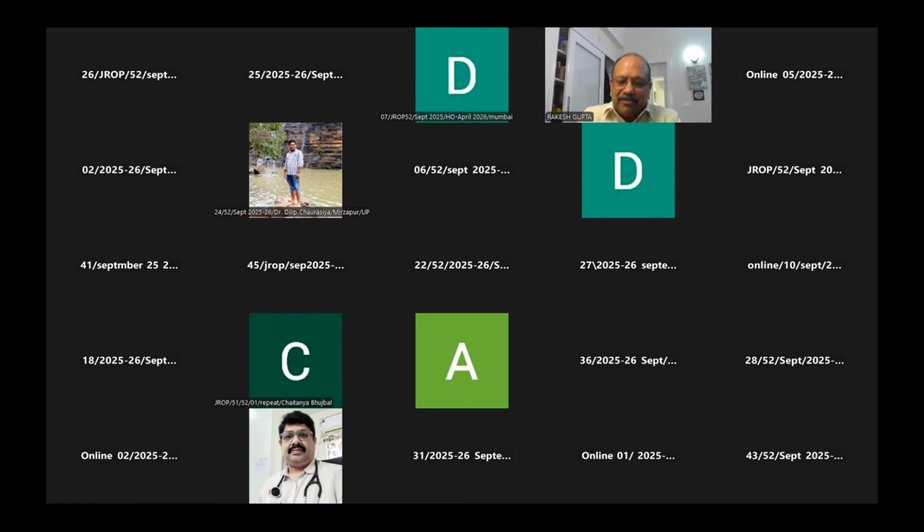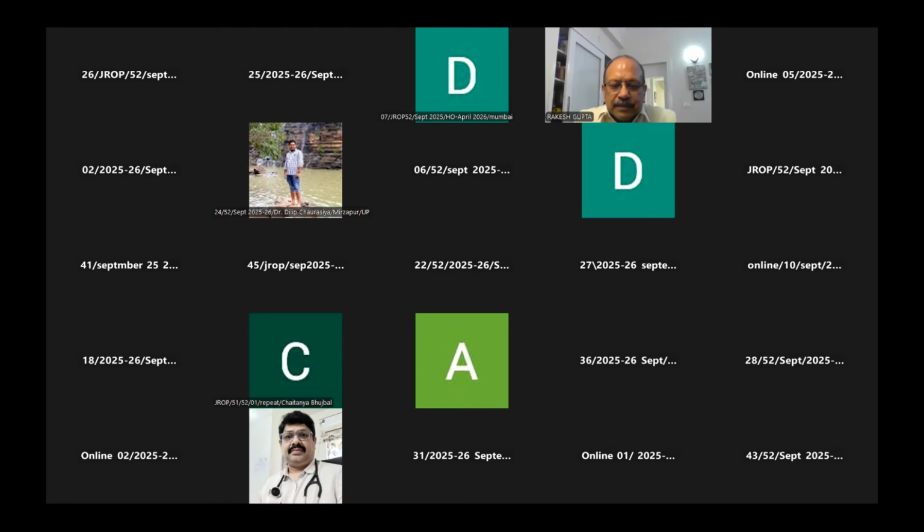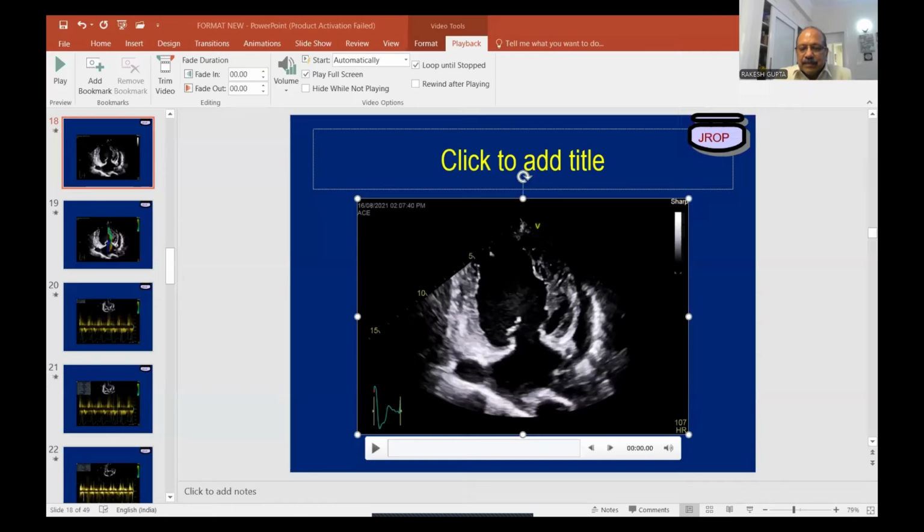So that thickening, when it becomes small, let me go back to my presentation. Just give me a second. I can show you the thickening from here only. Wait a minute. We cannot measure it. We can just assess it visually by our eyes. Can you see the slides now?